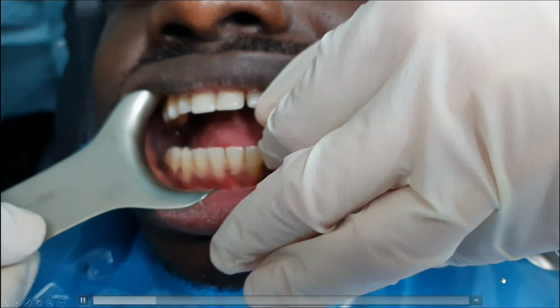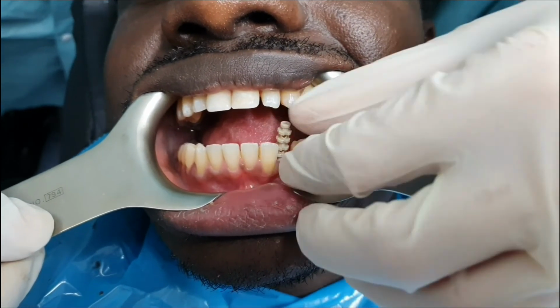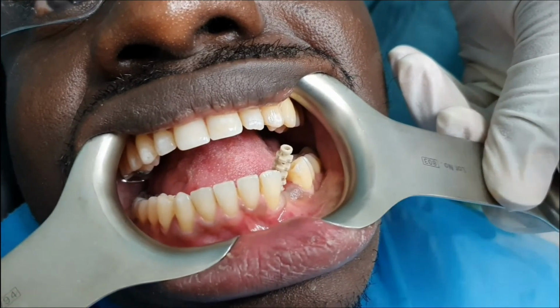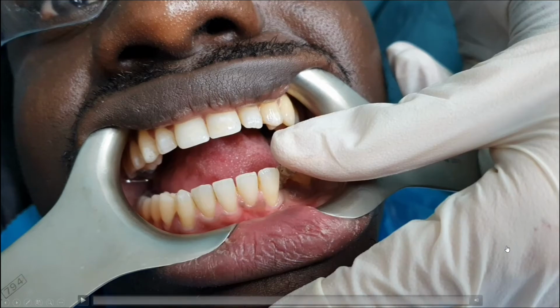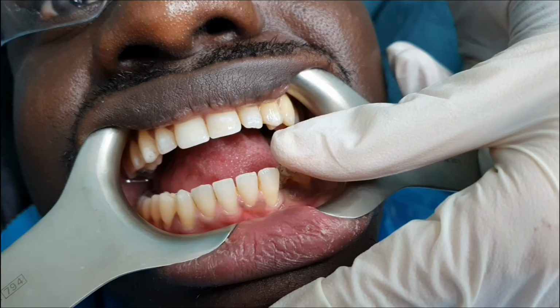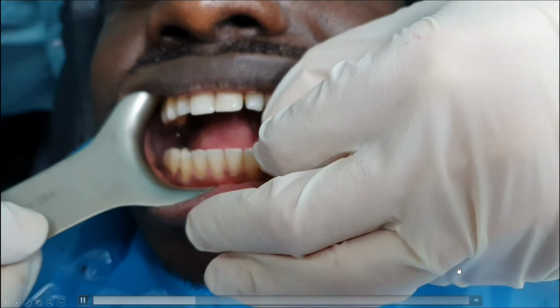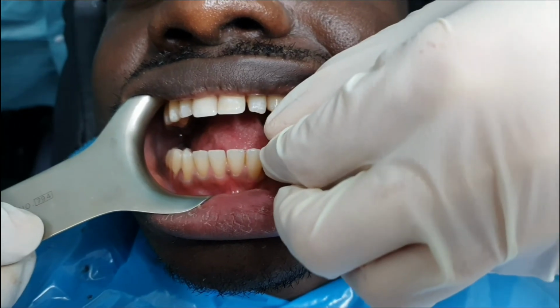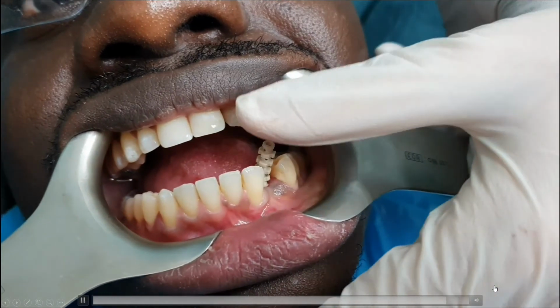The surgeon is just using a bit of force on it to actually bend it and reposition it so that it's handier to take the impression. Now this won't affect the accuracy of the impression in any way, and he's just positioning it so that he can have it lying within the tray. It doesn't have to be vertical at all. So again, you can see he's just placing it and he's bending it, and he can bend it distally, medially, he can bend it anywhere he wants in order to optimize the position within the tray.